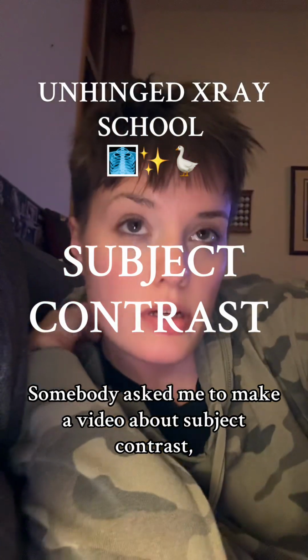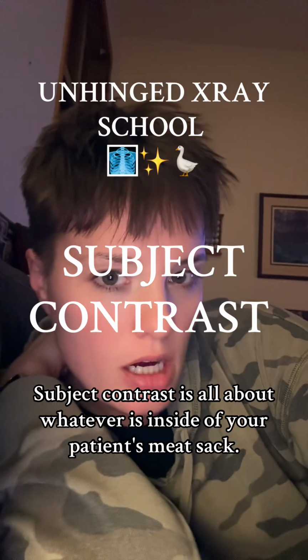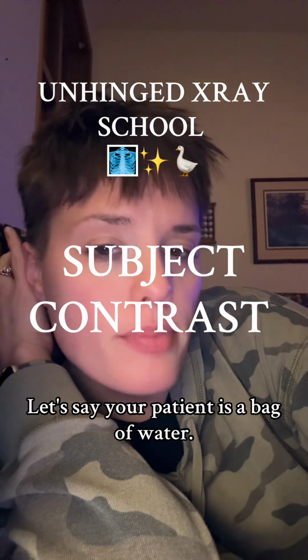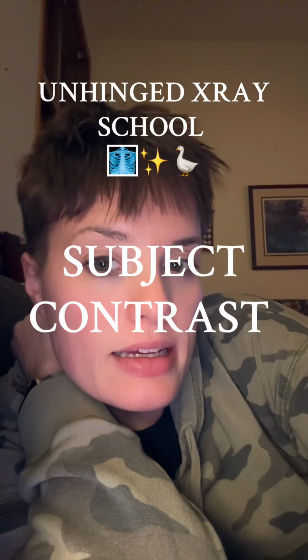Somebody asked me to make a video about subject contrast, so here's what you need to know. Image contrast is what the computer does. Subject contrast is all about whatever is inside of your patient's meat sack. Let's say your patient is a bag of water. The image that you take of them is going to look like a gray smoothie.